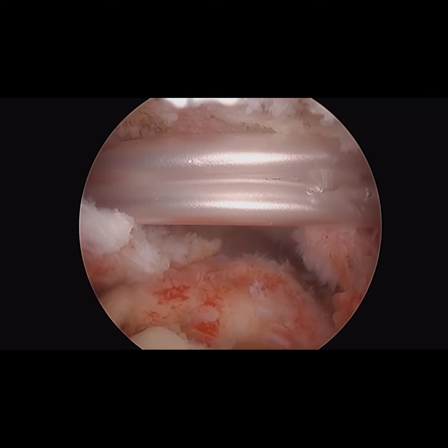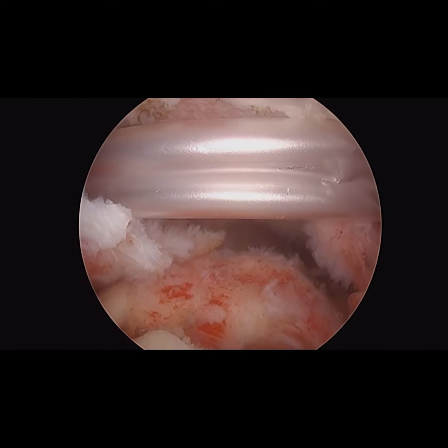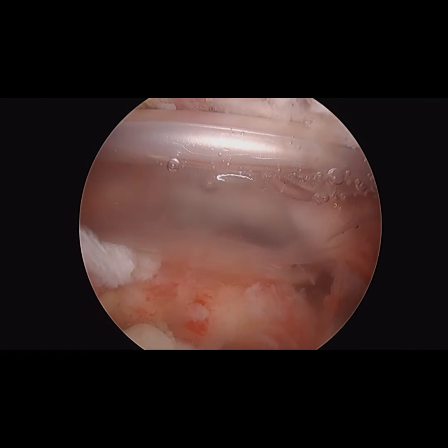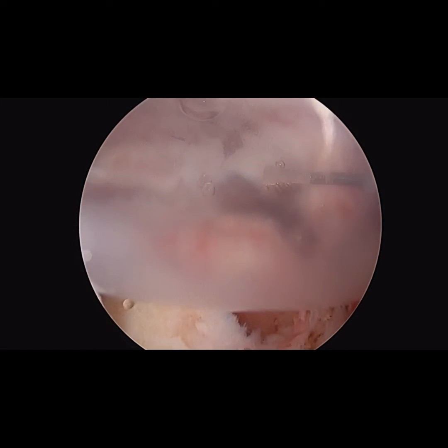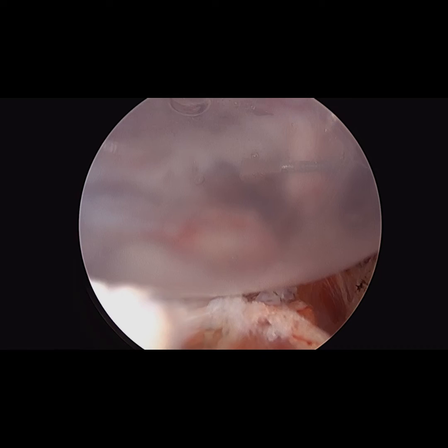The balloon is made out of a biodegradable material that helps to depress the humeral head in the absence of a functional rotator cuff, so that rehabilitation can be performed of the deltoid. The syringe is now being used to inflate the balloon, filling very nicely the subacromial space.